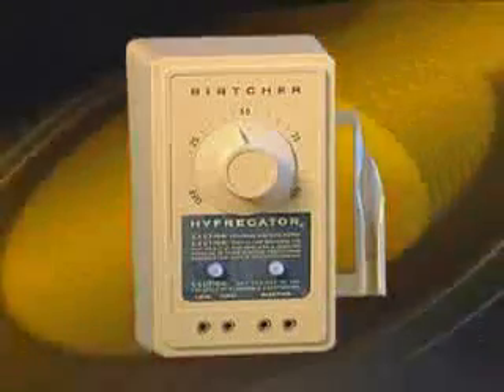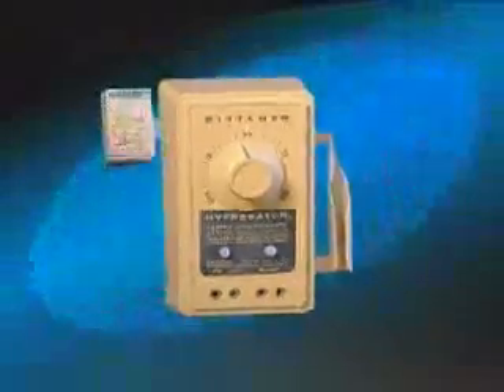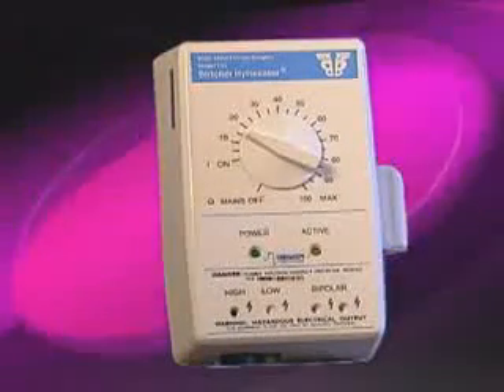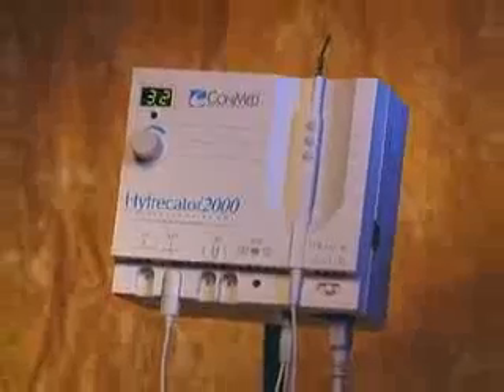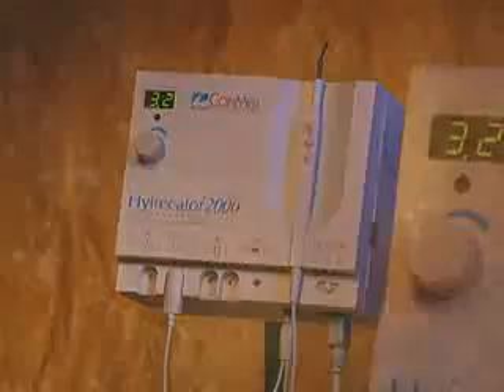This electrosurgical device is backed by the Conmed Corporation. Conmed, through its acquisition of the Birtcher Corporation, has a legacy of electrosurgical excellence dating back more than 60 years. Birtcher first developed the Hyfrecator in 1937. Over the years, it has evolved into the Conmed Hyfrecator 2000, growing more sophisticated in its capabilities and increasingly easy to use. Today, the Conmed Hyfrecator 2000 provides a broad range of applications at the lowest possible power setting.